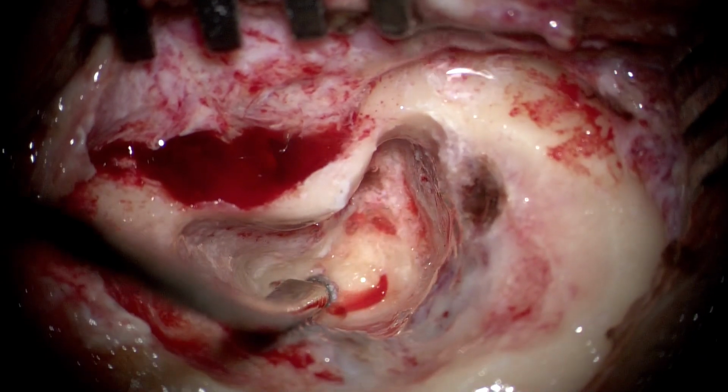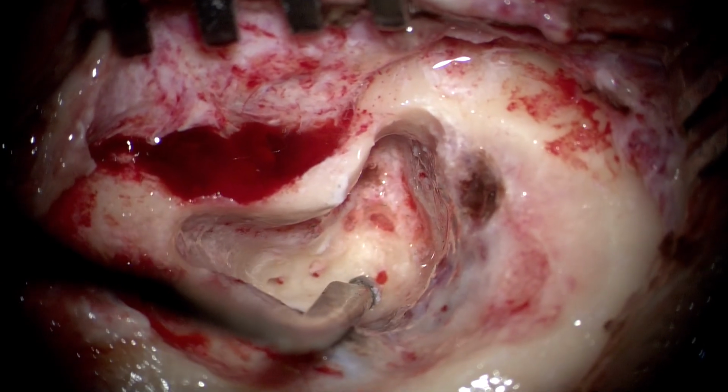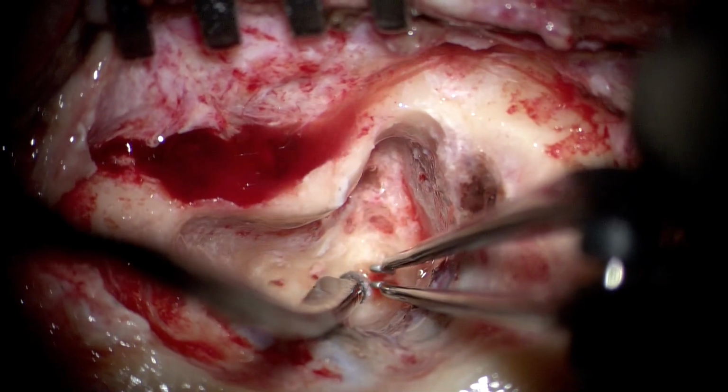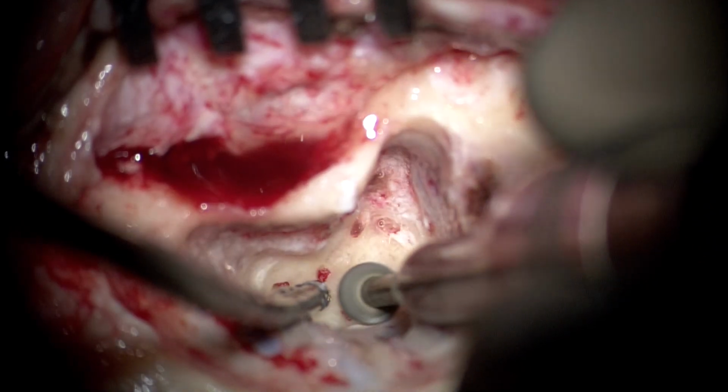One can again use the same fine bipolar or skull-based bipolars to coagulate the subarcuate vessel. Otherwise, one can also use some bone wax in this situation.